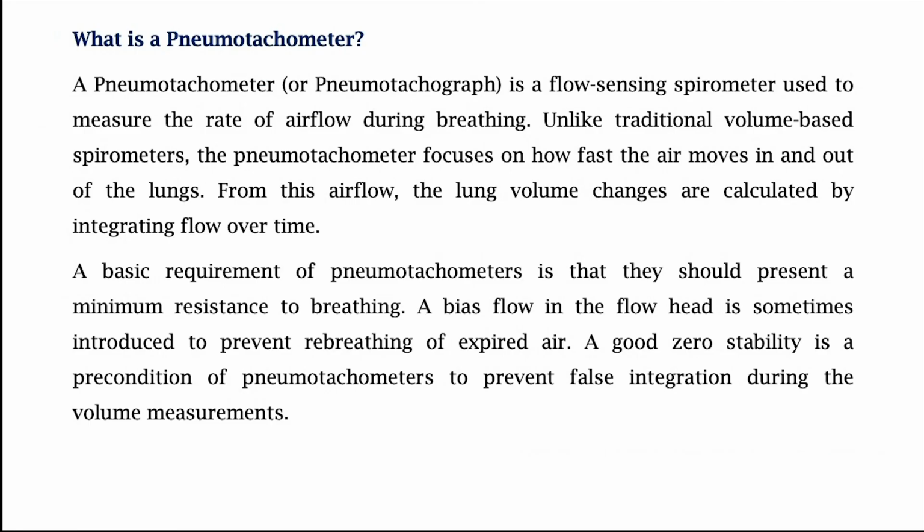But in this case, we are looking at air flow through the mouth as a form of flow. Air is also fluid. So essentially, we measure flow, and we use that to make diagnoses, come to certain conclusions about the nature of the respiratory system, about the breathing system.